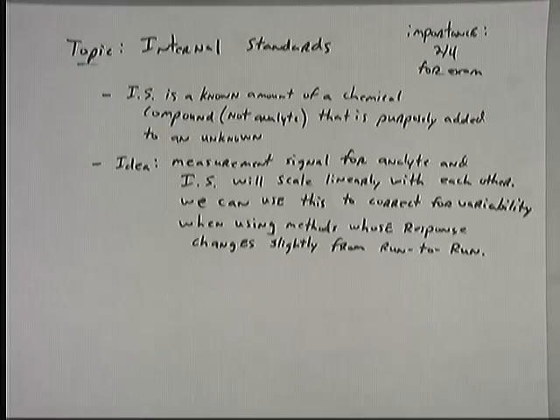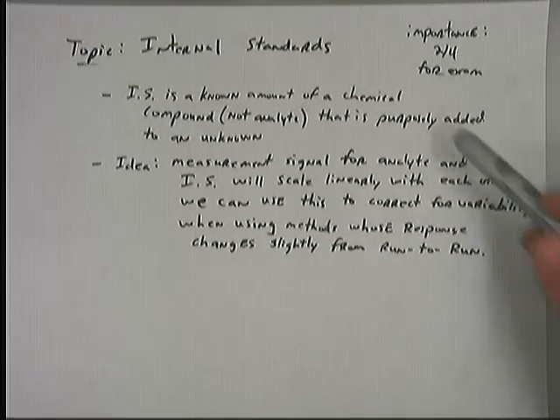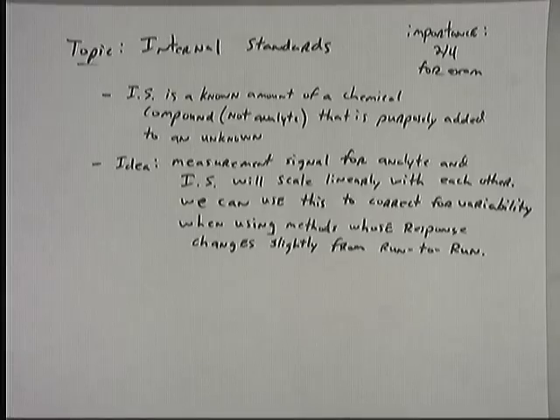And that's important to know about internal standards, because we are going to spike our sample with the internal standard, but we're adding this different substance. So it's not the same as standard additions, which has another video in this series.